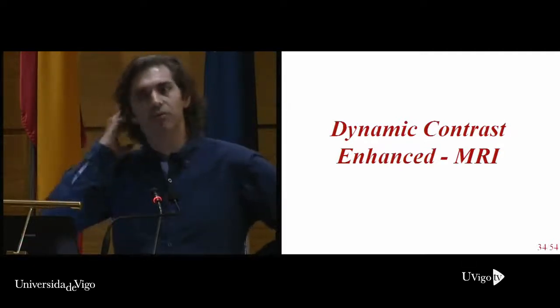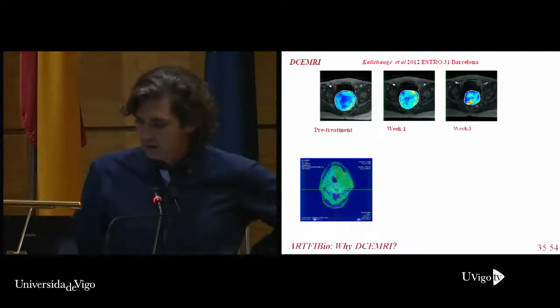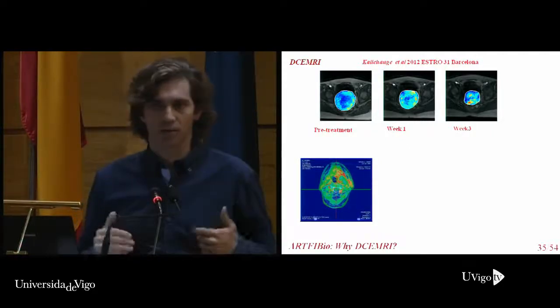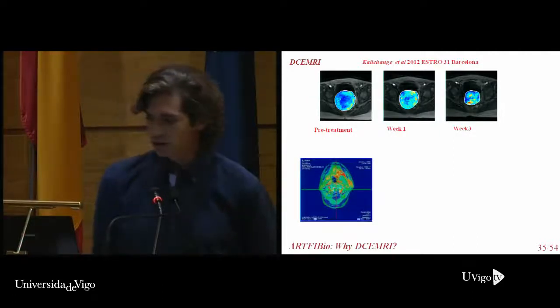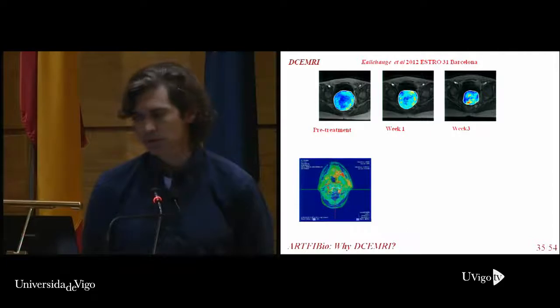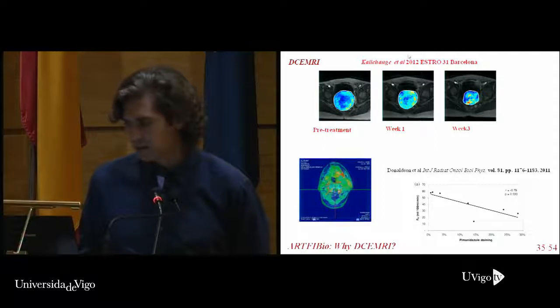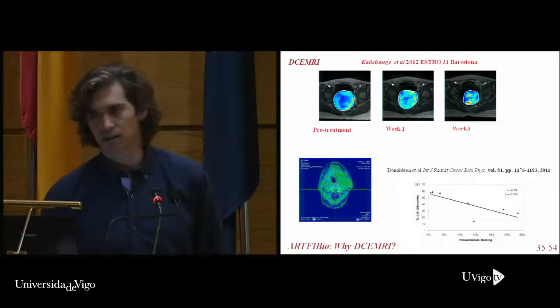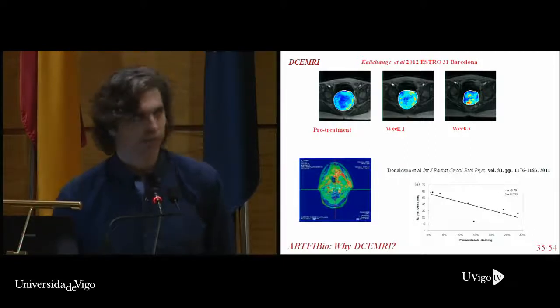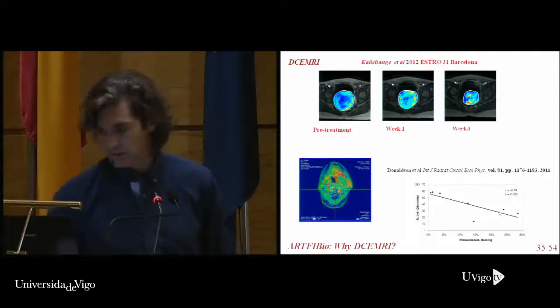And the third type of image we have is dynamic contrast enhanced. Dynamic contrast enhanced measures how the gadolinium is coming into the tumor. Some people have proposed it for tumor control assessment, but it's more clear that Ktrans or some parameters of this image can be associated with hypoxia.